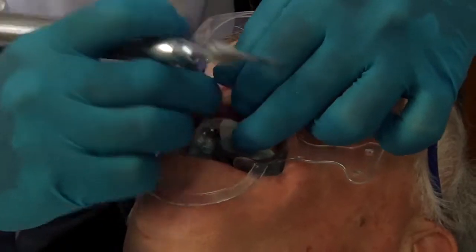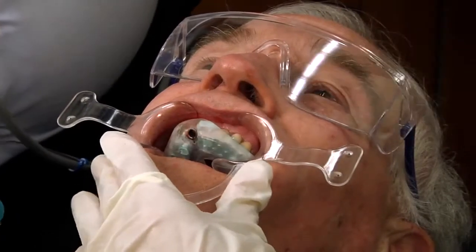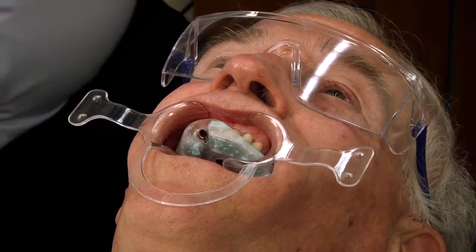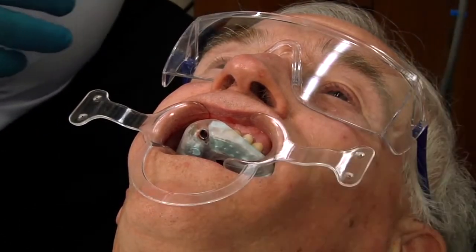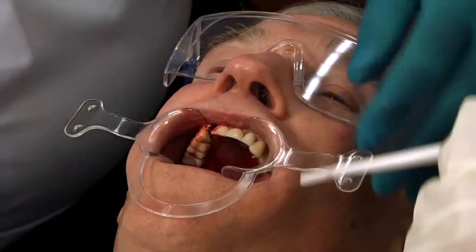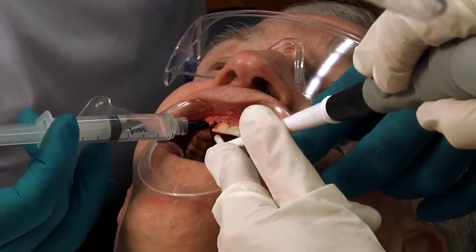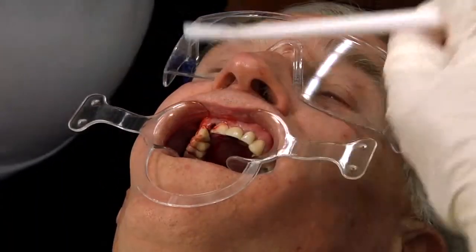Now in this particular situation, according to our plan and according to what we know, the actual osteotomy is done. If you notice, there are only two drills to use. So I take the surgical guide out and just flush to make sure I remove any bone chips and any tissue issues.